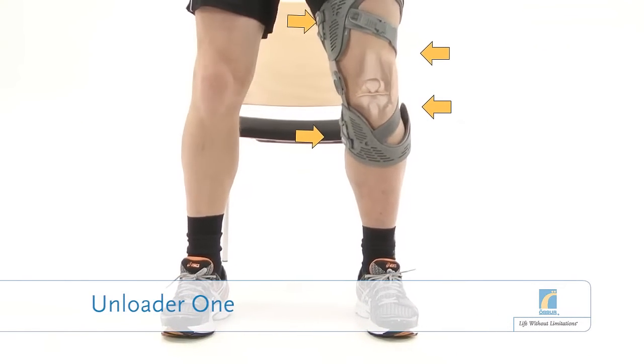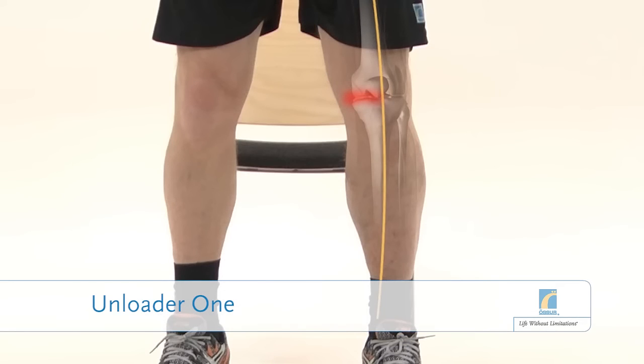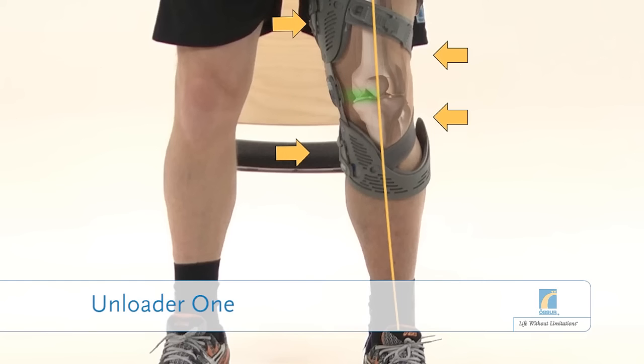The Unloader 1 knee brace is designed to help treat this condition. It reduces the load on the damaged area by transferring the load to unaffected parts of the knee.